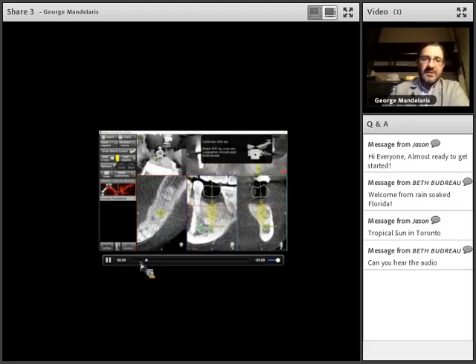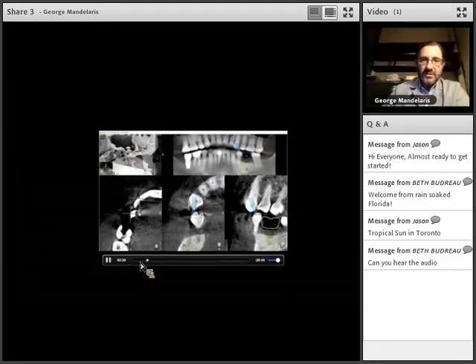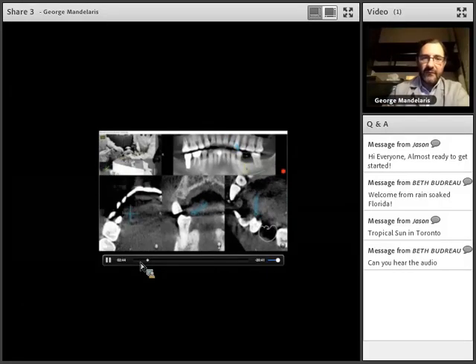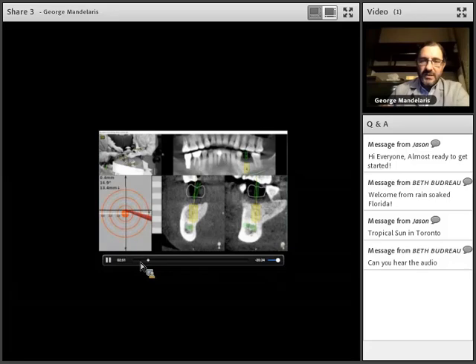And the important thing to do with this, unfortunately, I know this the hard way, I've made the mistake, is you don't want to cover the jaw tag. If the jaw tag can't be seen, then there's an error already. There's a problem. So make sure your staff knows where their hands are, because the natural tendency is for them to hover over the patient on the right side, like her assistant is doing, and cover that jaw tag. So here she's registered the drill tip. That seems to be accurate, and now we're going ahead and trying to get the entry point.